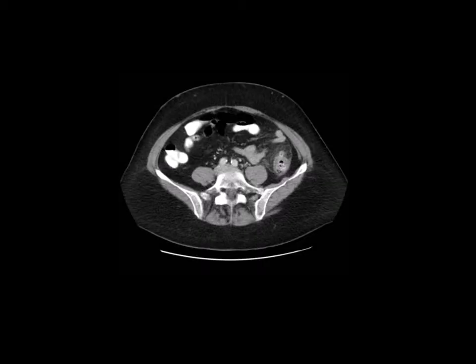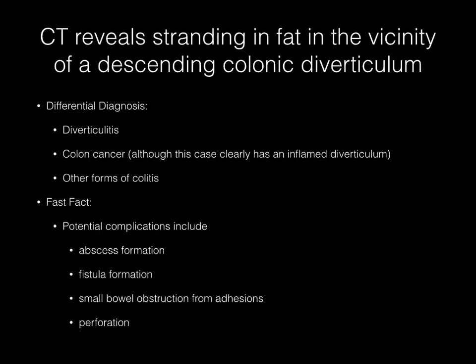Now pause your media player. Axial CT image reveals stranding in the fat in the vicinity of a descending colonic diverticulum. The differential diagnosis should include diverticulitis, which is most likely, or colon cancer — although this case clearly has an inflamed diverticulum present — and other forms of colitis.